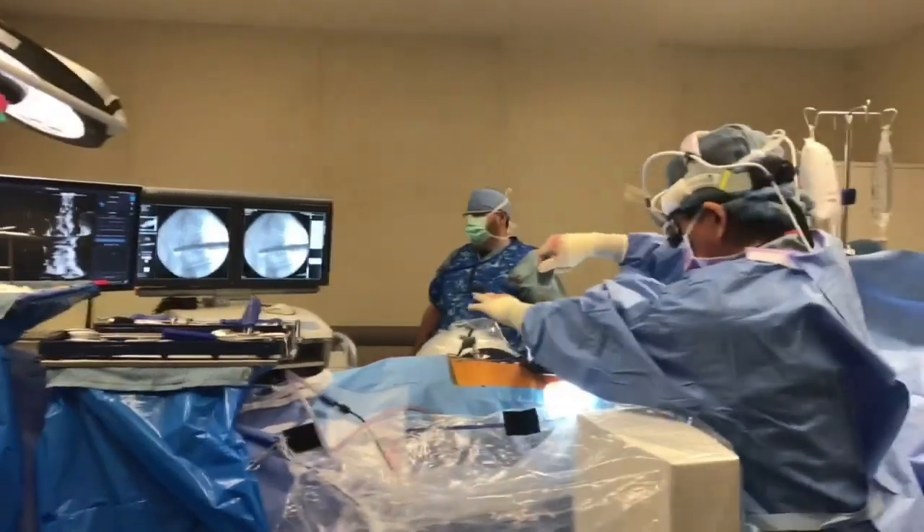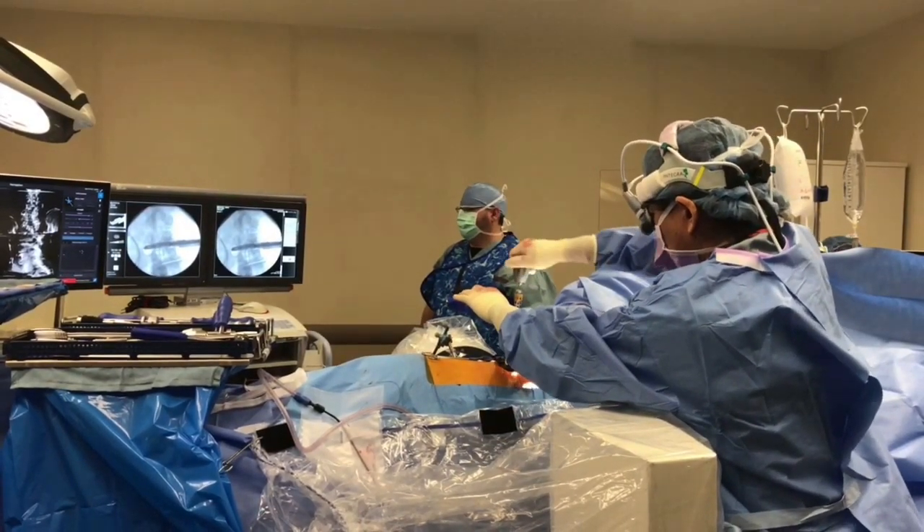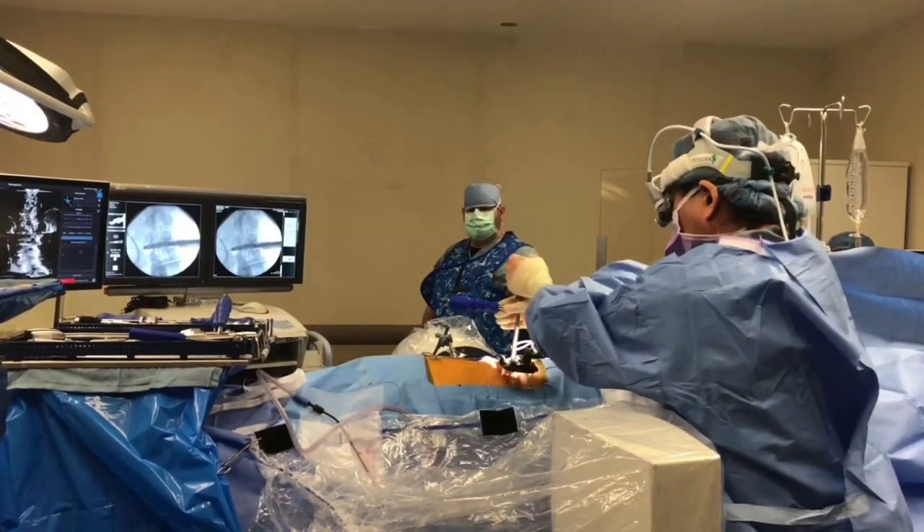I have the first implant in and I'm turning this dial to make the implant get bigger and bigger and bigger, expanding in situ. That's how I put something in through a small opening and still fill a larger opening.